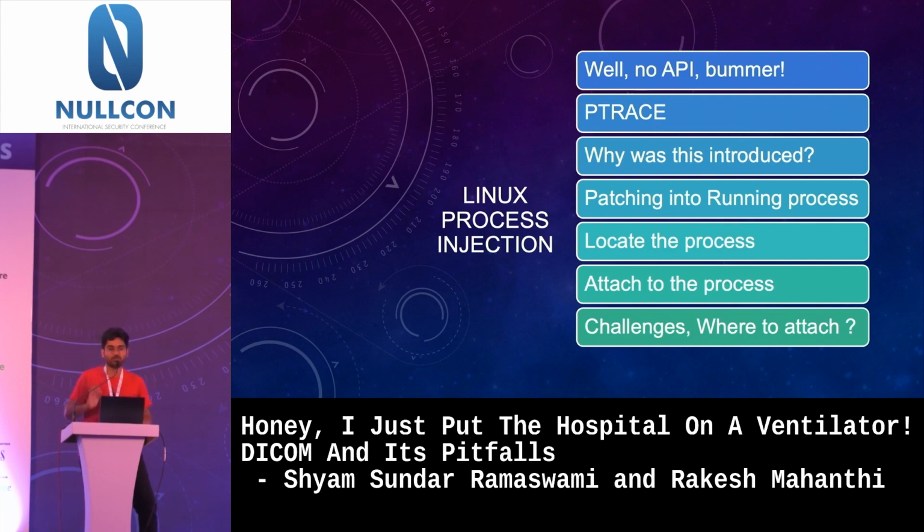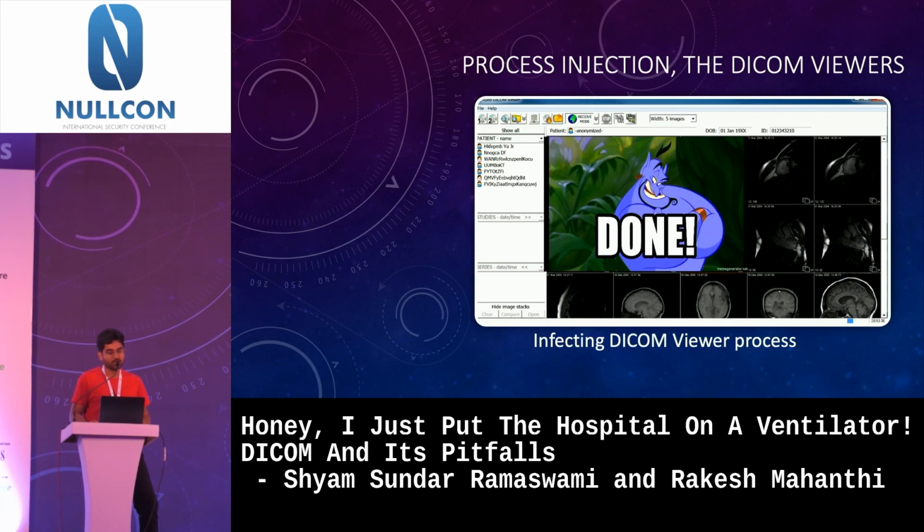Memory is a problem for most of us, but just try to remember this. Do you remember seeing this image in my first slide? Which was showing what? X-ray. Now, did you see the genie there? That is basically the injected process. So we converted the DICOM reader using process injection into a bad process which keeps running, can talk to the command and control server, download additional malware and do lateral movement in the network.